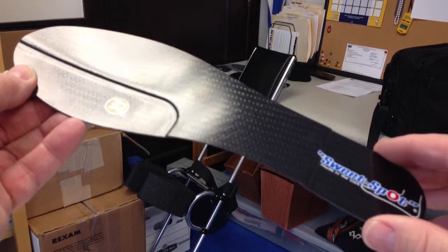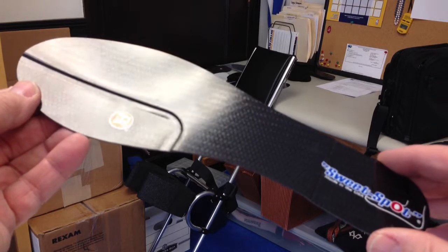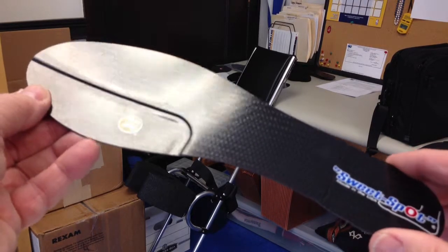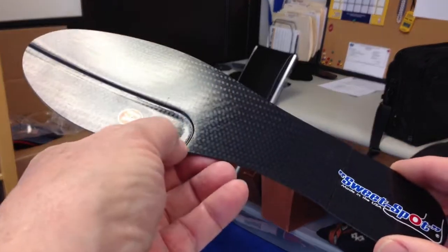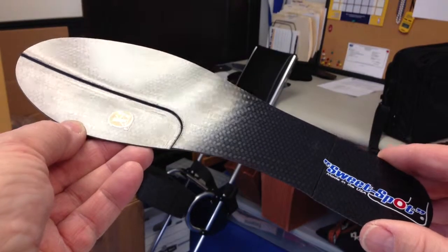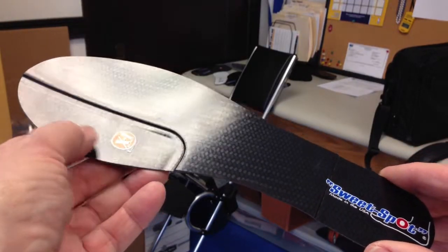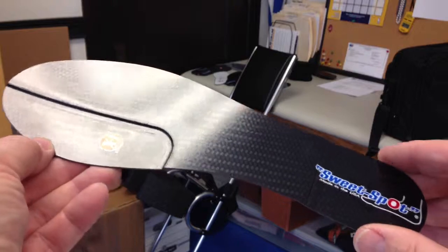Hi, this is Clyde at indianabrace.com. We're talking about our X1 blade. This one is for sesamoiditis. You can see that there's a relief right underneath the sesamoids. A lot of times I would get a prescription from a physician saying, hey, I've got an athlete with sesamoiditis. So we found this relief to be quite beneficial for that athlete.